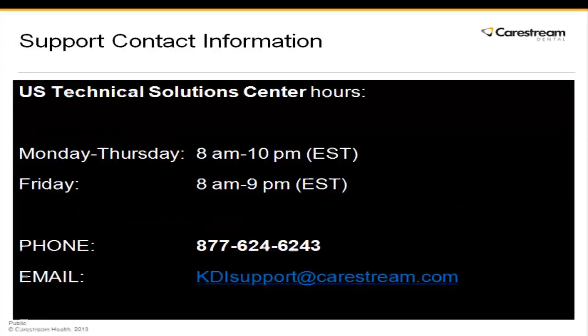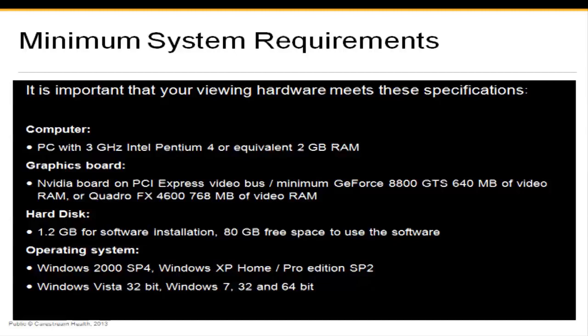If you encounter any problems or have any questions about any of the steps covered in this lesson, please do not hesitate to contact us for support. Please also take note of the system requirements for best software performance. Remember, if your graphics card does not meet these requirements, you may not be able to see a 3D rendering.